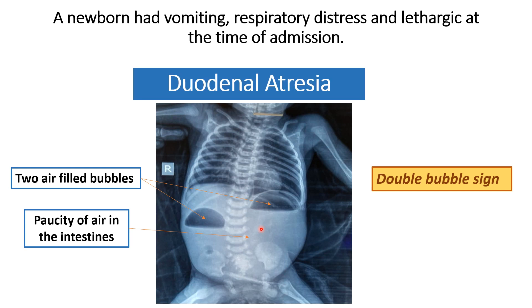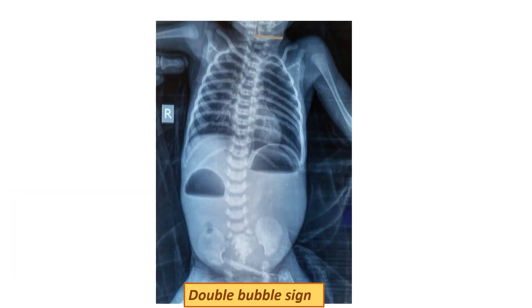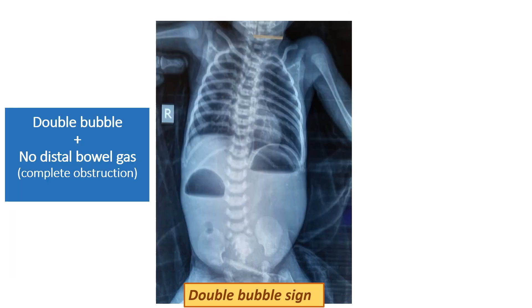This is suggestive of duodenal atresia — the diagnosis for this X-ray is duodenal atresia. Whenever there is a double bubble sign with no distal bowel gas, as in this X-ray, it is suggestive that the patient is having complete obstruction at the level of the duodenum.